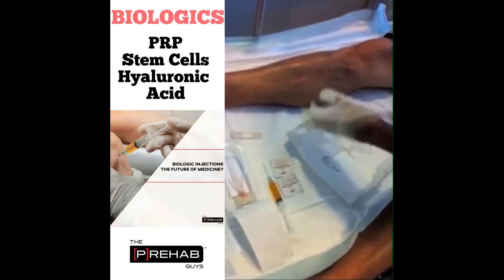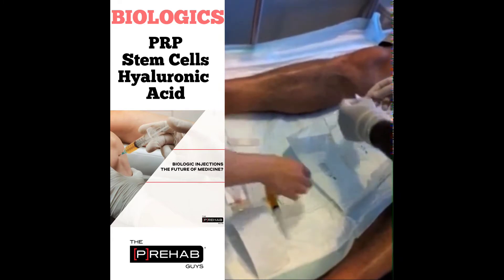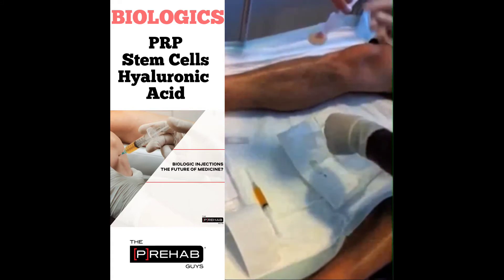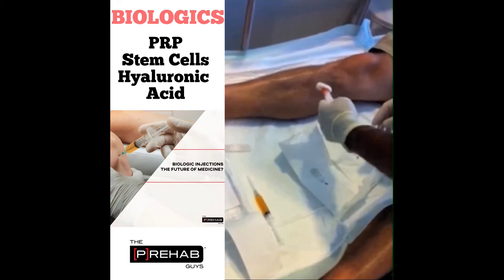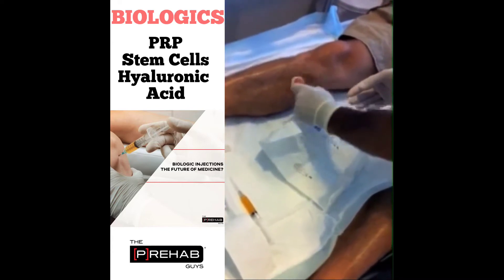The PRP is prepared in the usual fashion. In this particular instance, 10 cc's of blood are centrifuged down to achieve three to four cc's of PRP. The area to be injected is localized by manual palpation to find the epicenter of pain. In situations where muscle or tendon are injected, we often utilize ultrasound to assure that the injection goes to the appropriate area.